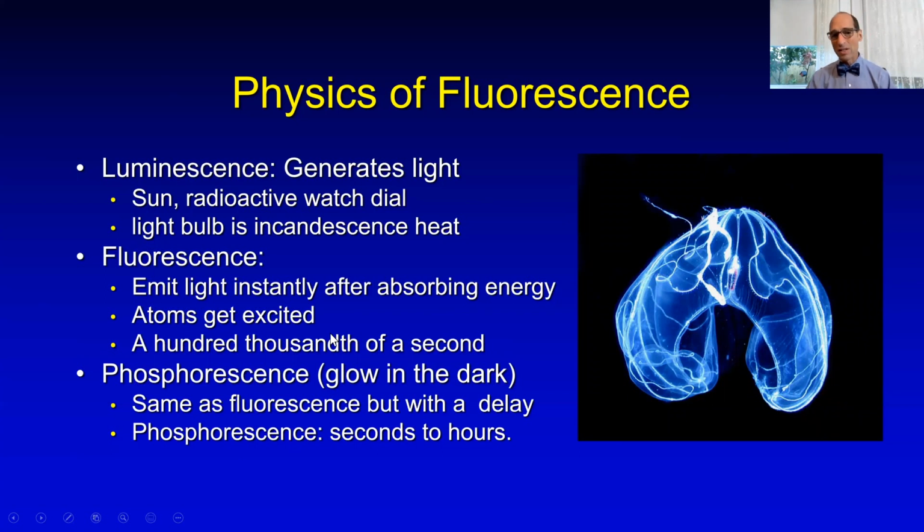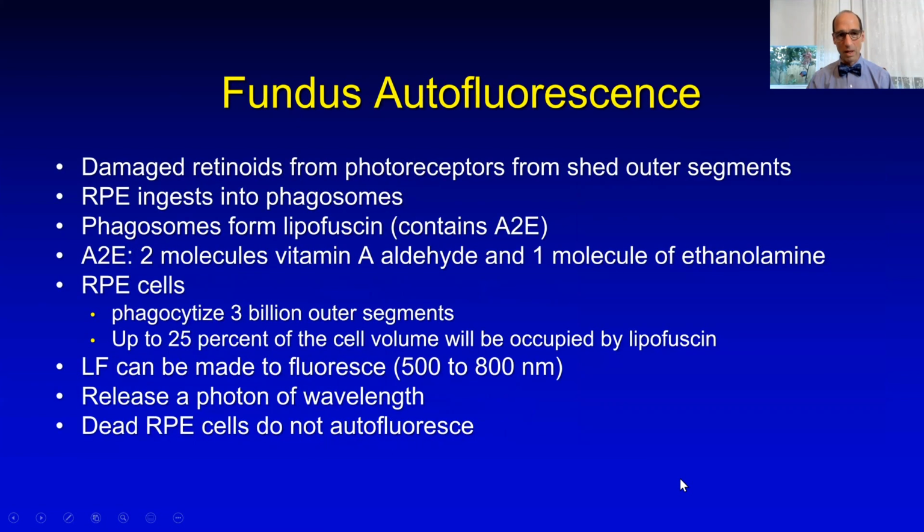The reason I say this is just so you know fluorescence. When you do indocyanine green angiograms, that's still fluorescence. People use the word cyanescence even in journals, and as far as I know, it's not yet an actual word, because really the indocyanine green fluoresces, even though it's not called fluorescein.